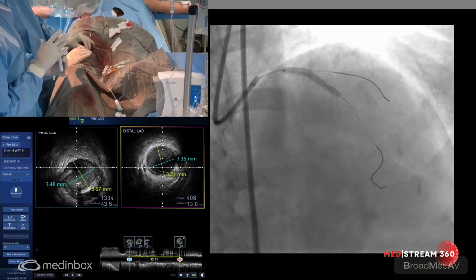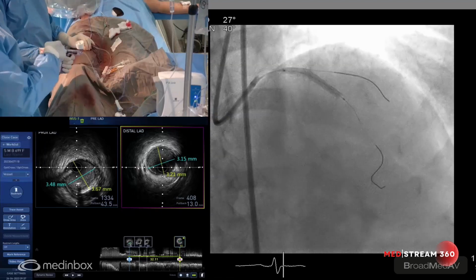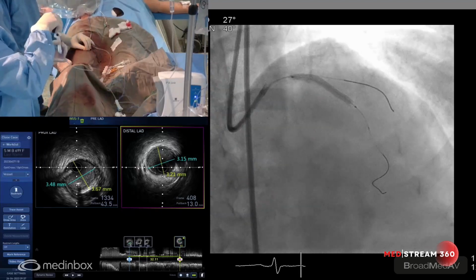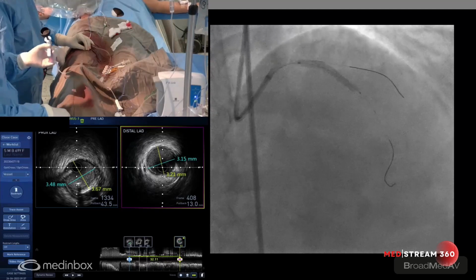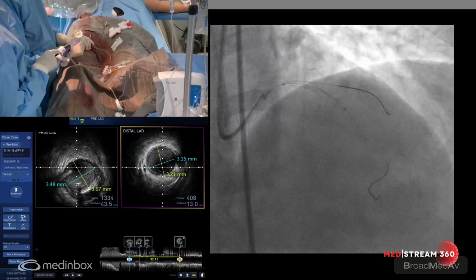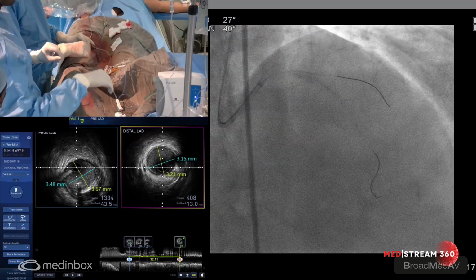You can see that the stent has uniformly come up after the debulking with no issues. Yeah, deflate and go up once more. With these long lesions, it's better to do a couple of dilatations of the stent so that we can get a good result. Deflate, please. Get that stent balloon out.